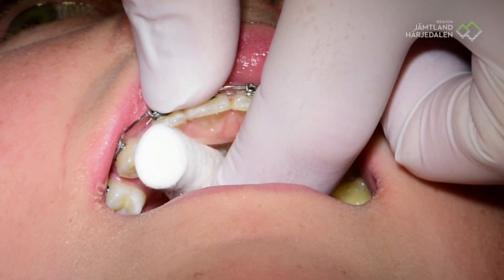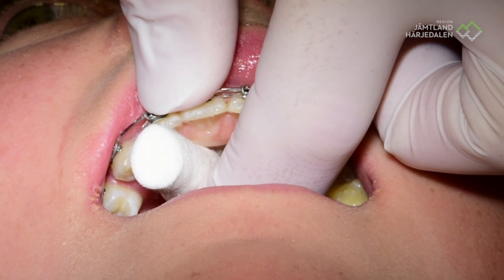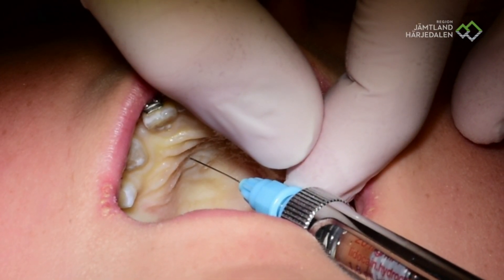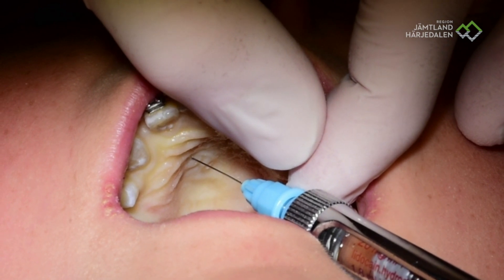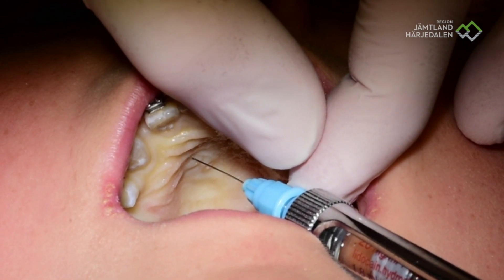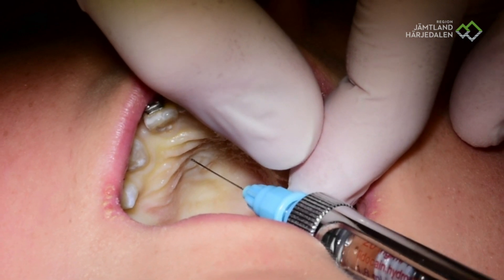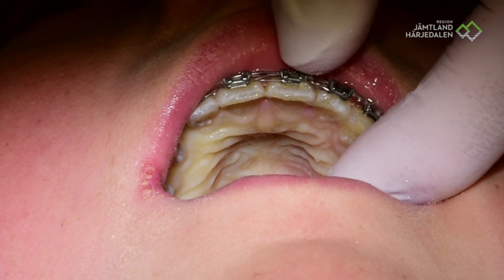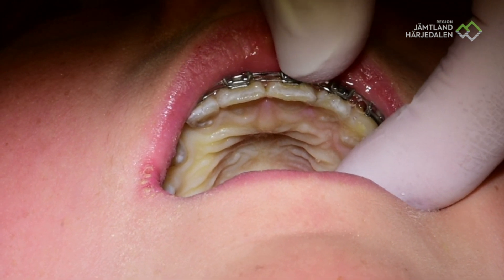After the anesthesia, then we have the fun thing. I am always generous with the anesthesia because it is much better for the comfort of the patient. We are finished with this procedure — now we have the fun. I promise you, you are completely anesthetized, so it is impossible to feel any pain.